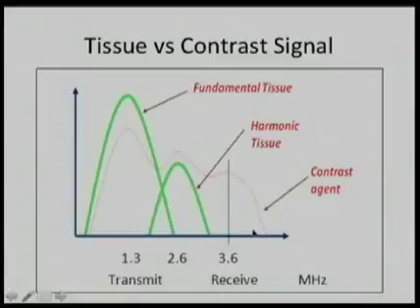And so using this particular modality really enables you to see the bubbles well, because it suppresses tissue and looks at the bubbles. Again, there are many different ways of doing this, and each manufacturer has their own proprietary way, but it's important to use the settings that the manufacturers provide because they're all pretty good.